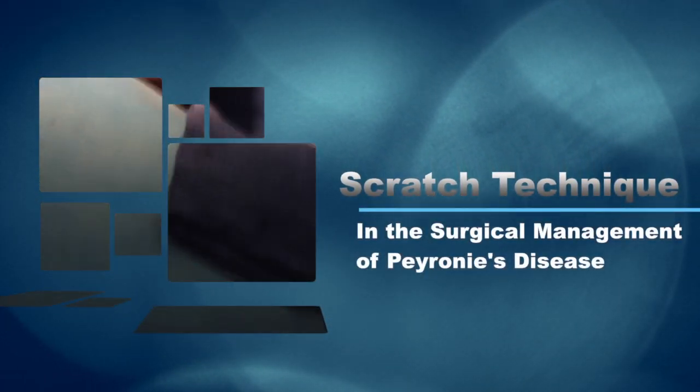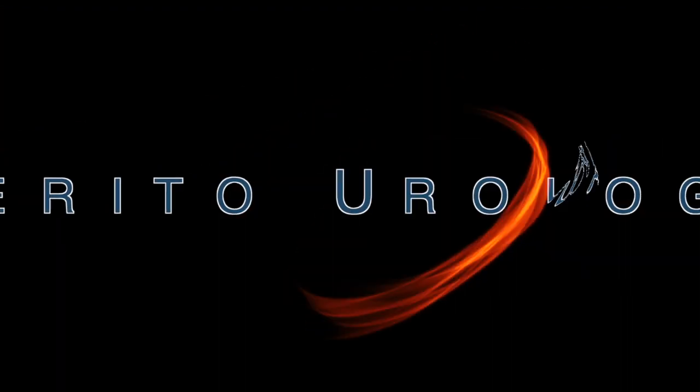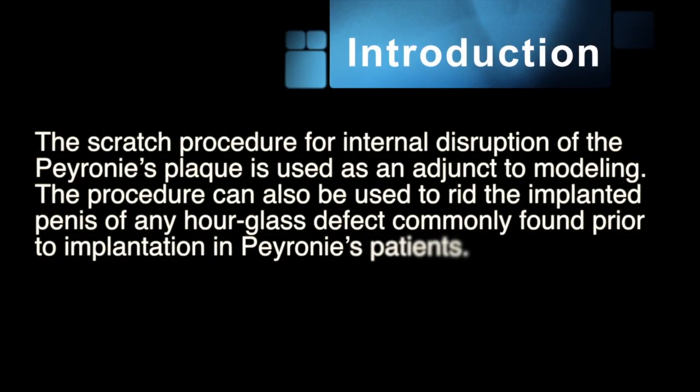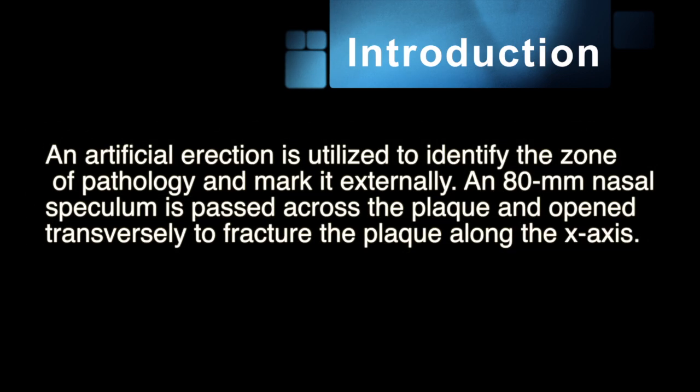The Scratch Technique in Surgical Management of Peyronie's Disease. The Scratch procedure for internal disruption of the Peyronie's plaque is used as an adjunct to modeling. The procedure can also be used to rid the implanted penis of an hourglass defect commonly found prior to implantation in the Peyronie's patient. An artificial erection is utilized to identify the zone of pathology and mark it externally.